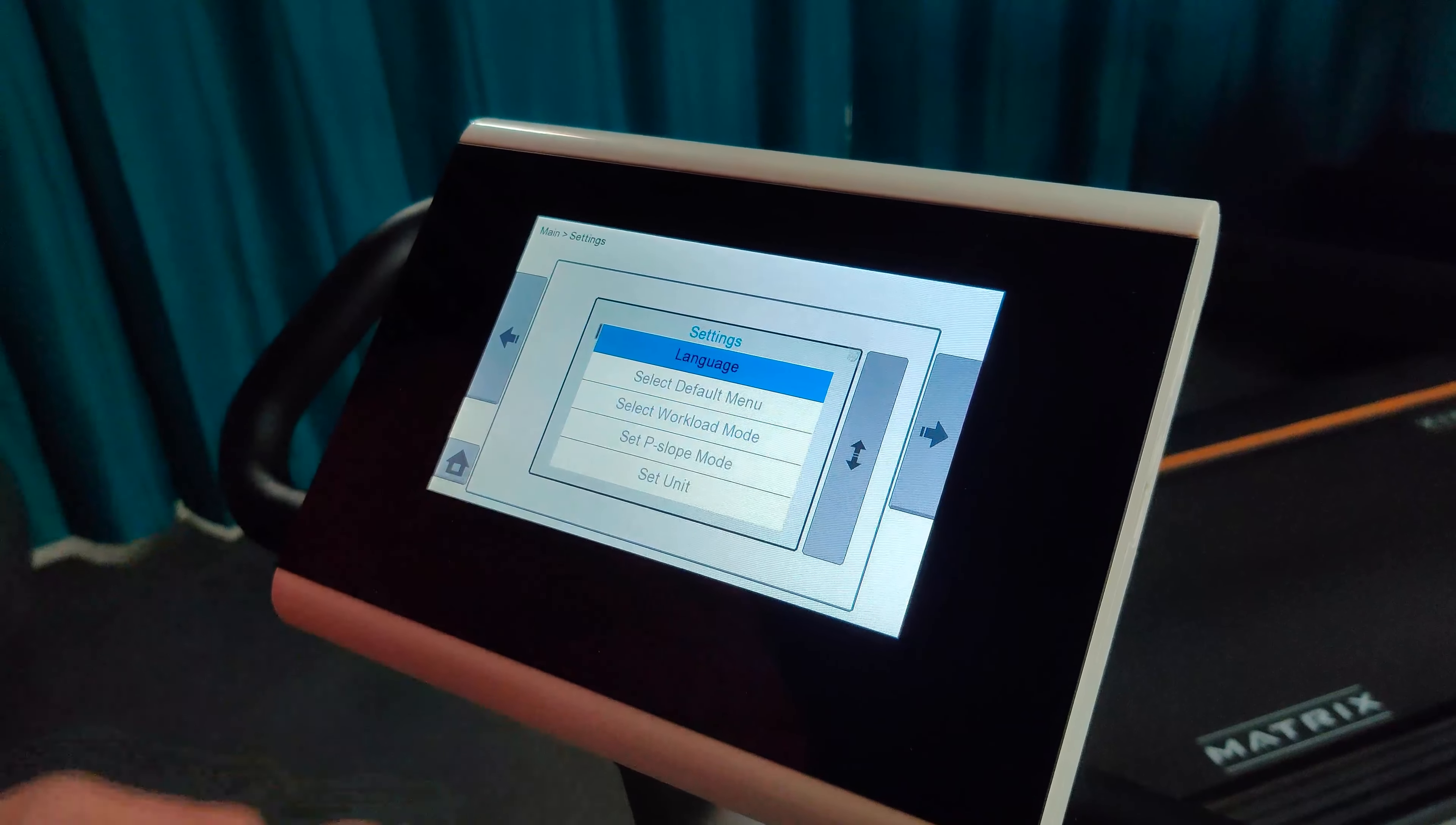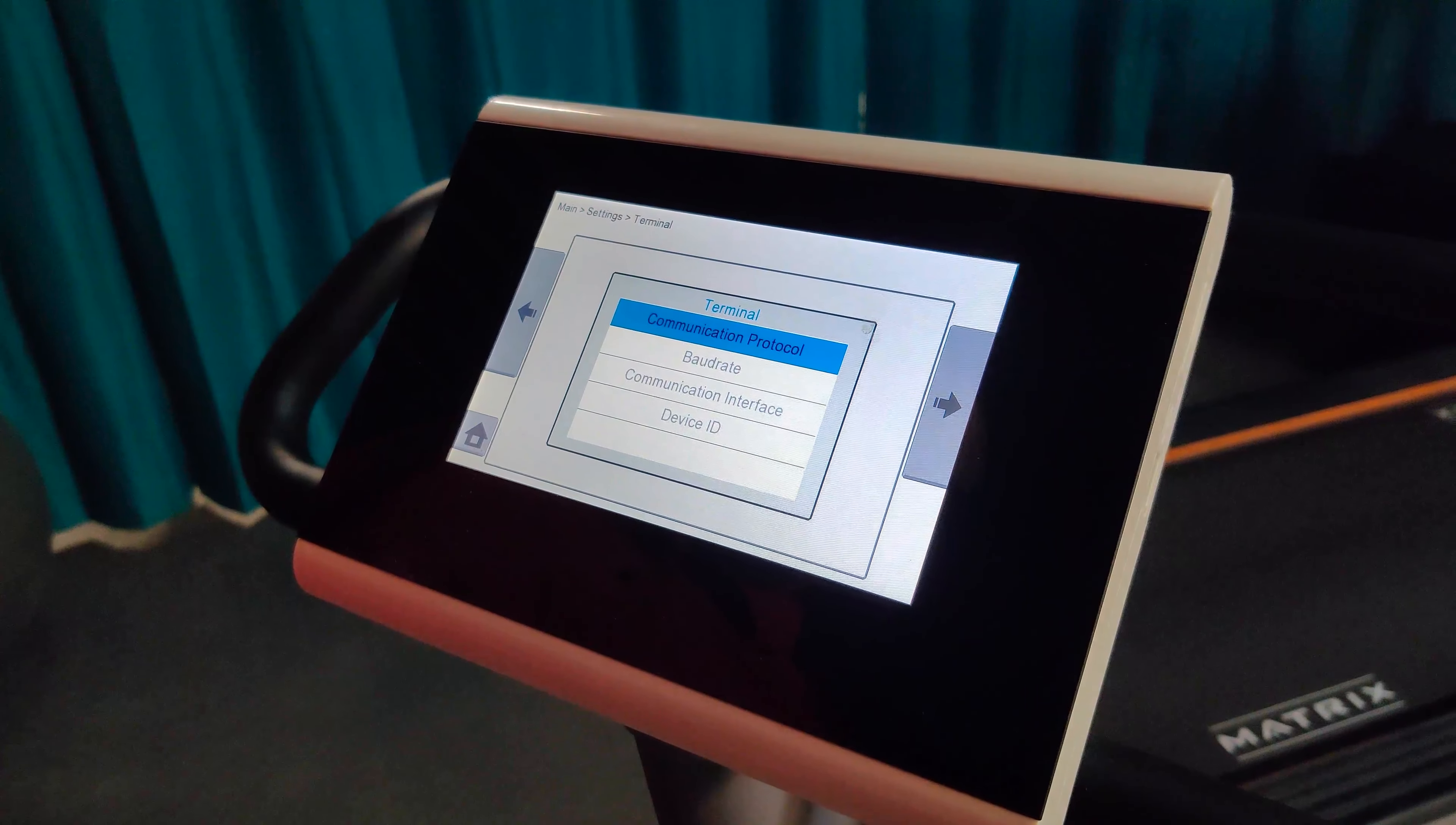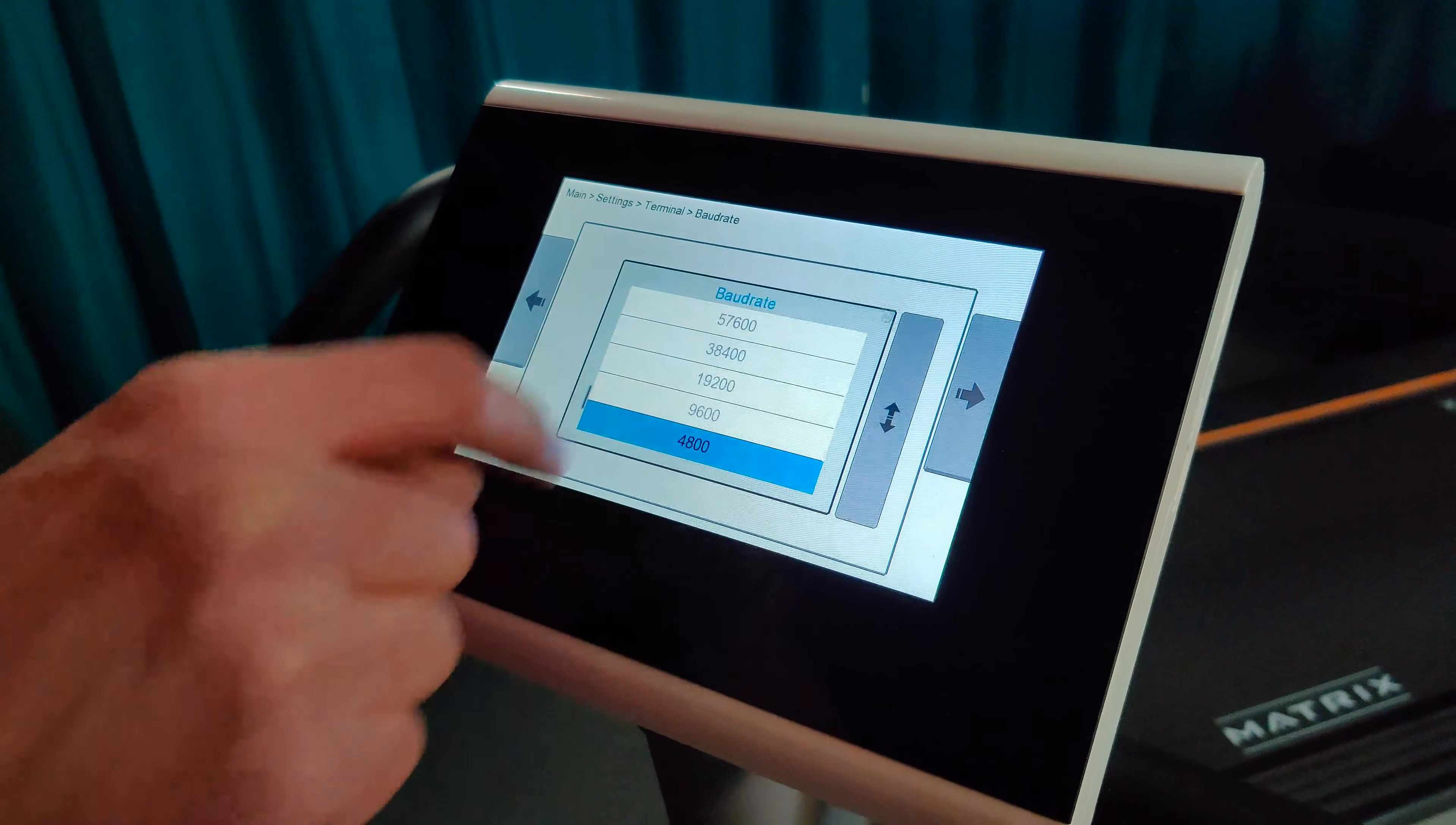Go to Settings, then go down to Terminal Settings. Make sure Communication Protocol is set to Load Protocol. Under Bode Rate, select Default.